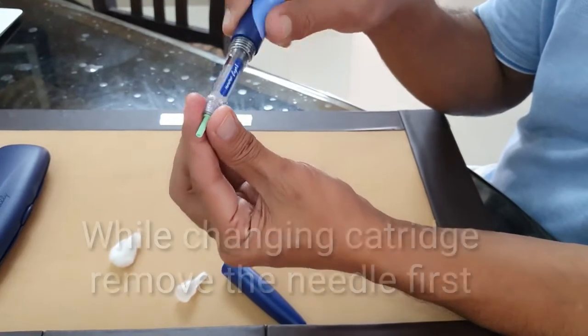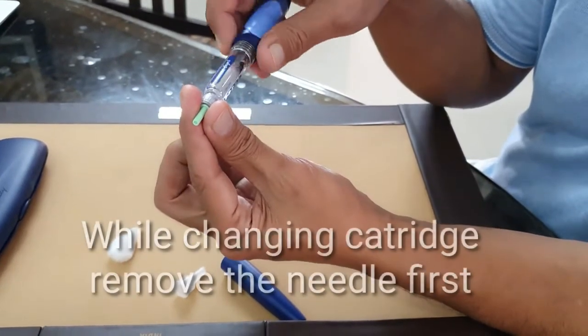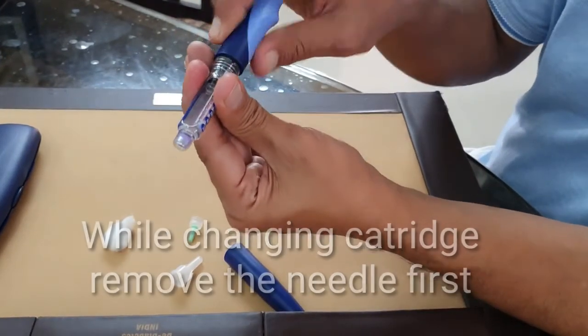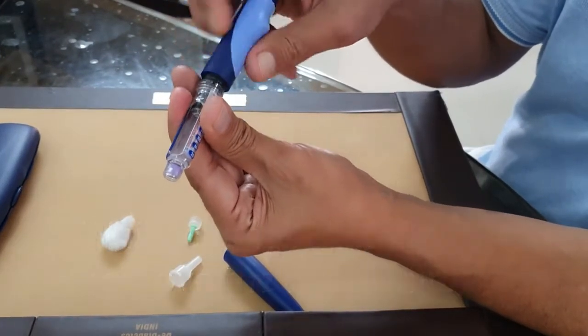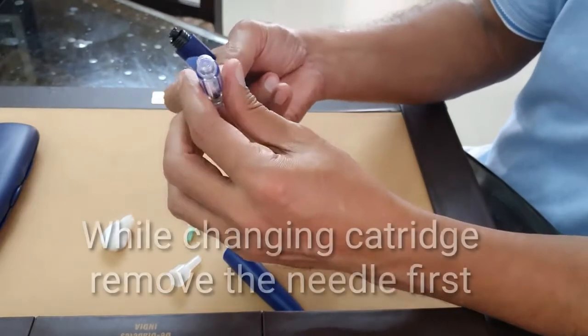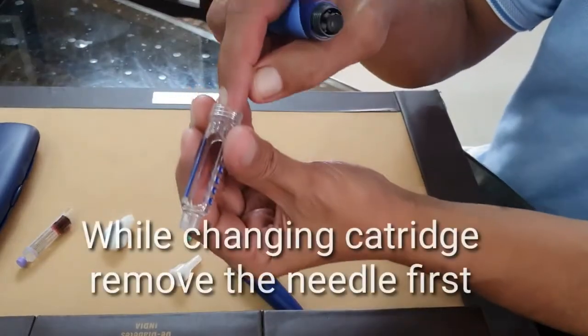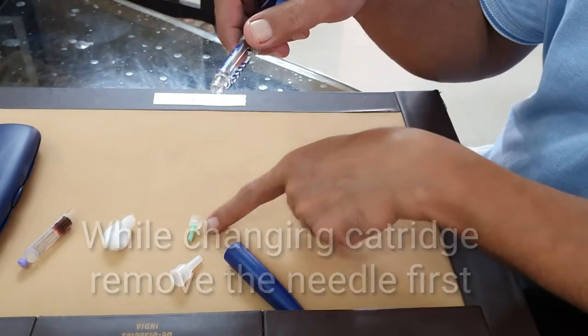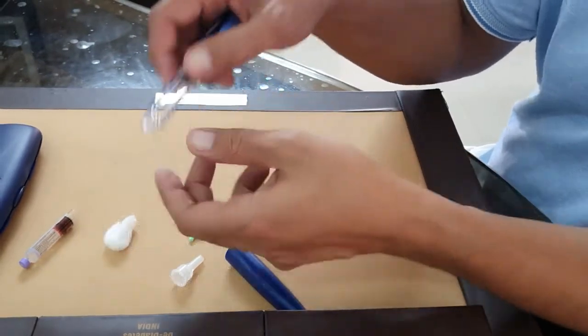Finally it reaches the end and you'll not be able to inject. Once it's over, you're going to remove the needle first, then remove the cartridge. Once you remove the cartridge, put a new one and tighten it, then put the needle. If you don't remove the needle first, you will not be able to remove the cartridge.